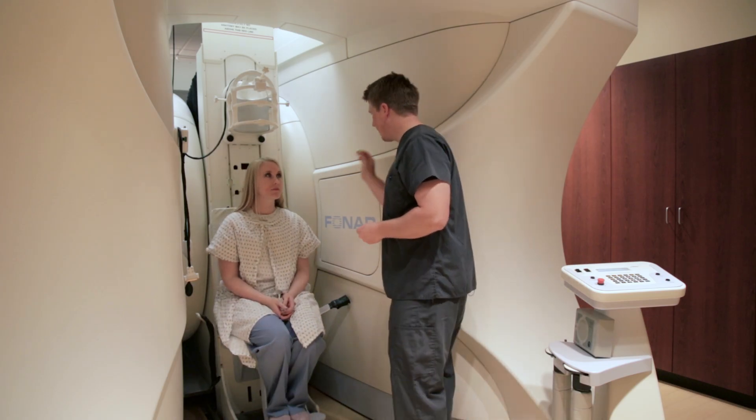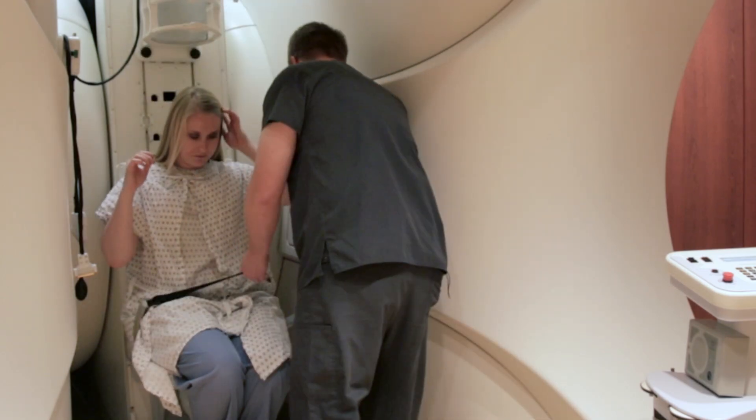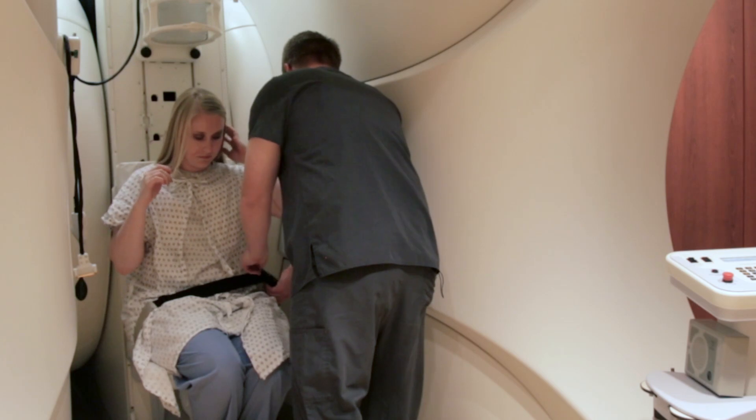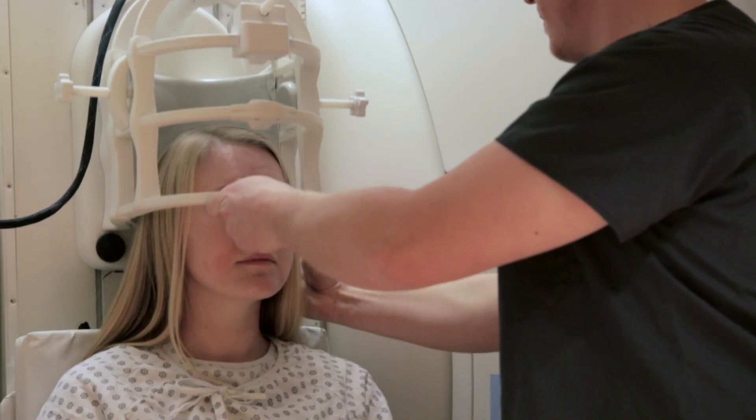We're going to give you some earplugs to help protect your hearing. When we have a patient that needs to have an MRI of their brain, we'll have the patient sitting in the chair. And what we'll do is bring the coil down over the top of their head — it's like a football helmet when we put it on.